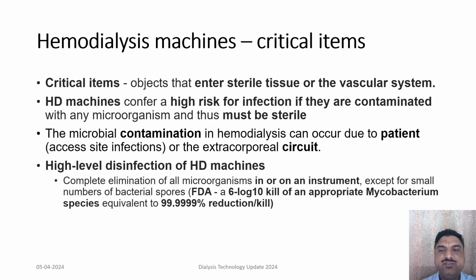So hemodialysis machines are considered very critical items. Critical items are the objects that enter the sterile tissue or vascular system of the body. HD machines can cause a very high risk of infection if they are contaminated by microorganisms, and thus they must be sterile when used.